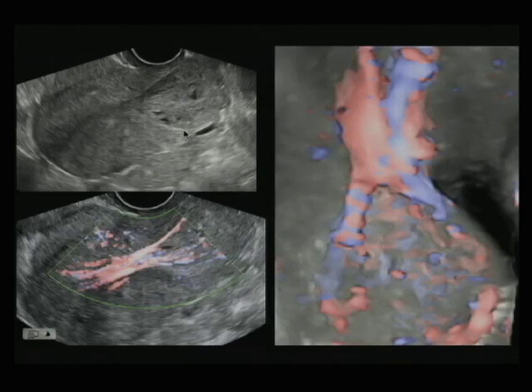When we turn on the color, you can see that there's a huge amount of blood flow going down through the stalk to the polyp. And in fact, there is more blood flow than I would ordinarily expect for just a polyp. And here it is in 3D showing the vasculature to this polyp. In fact, this was not a polyp. This was a sarcoma on a stalk that was actually protruding through the cervical canal.